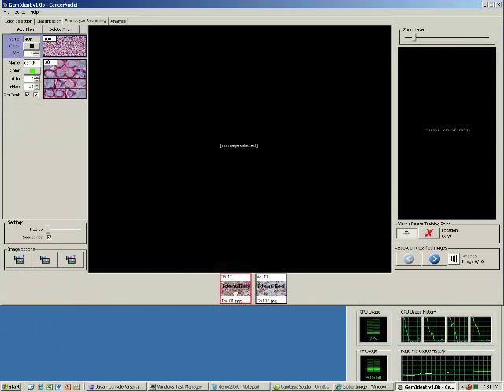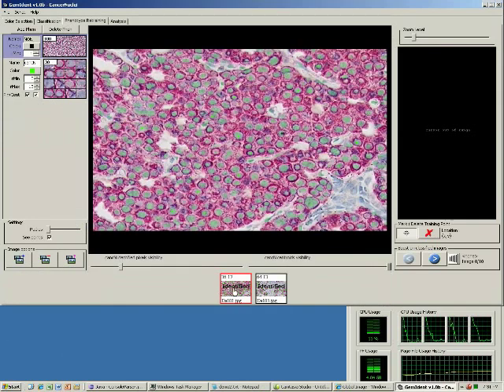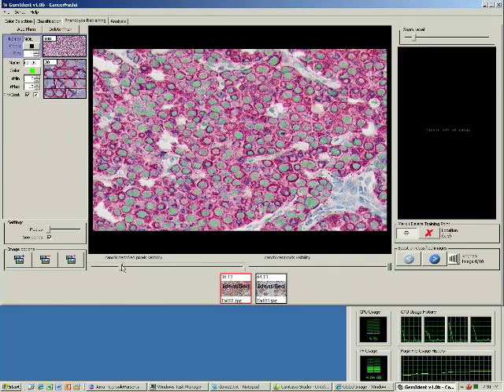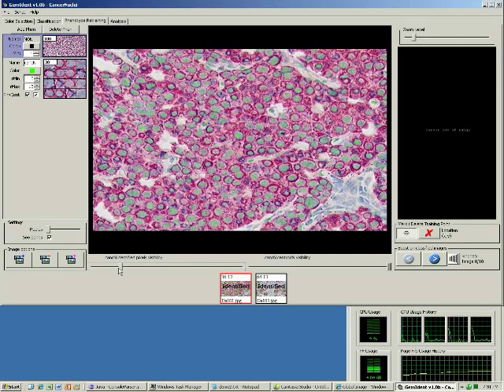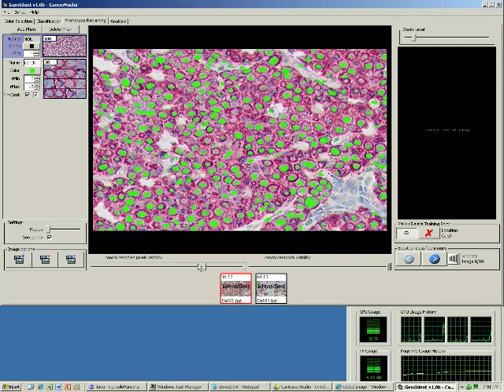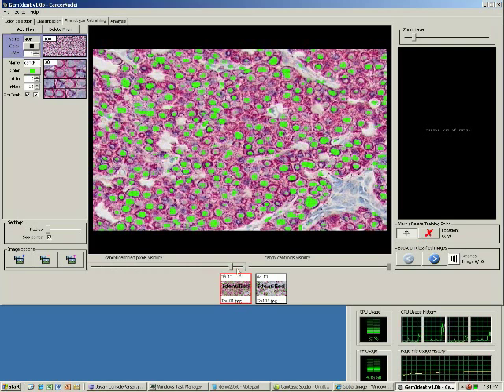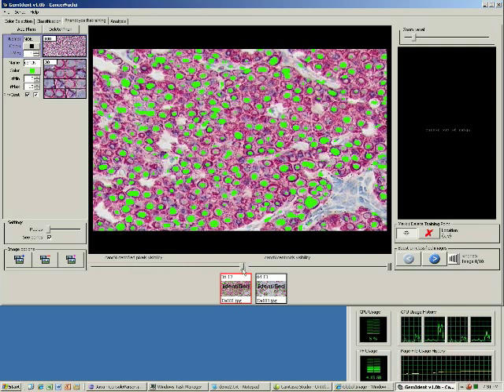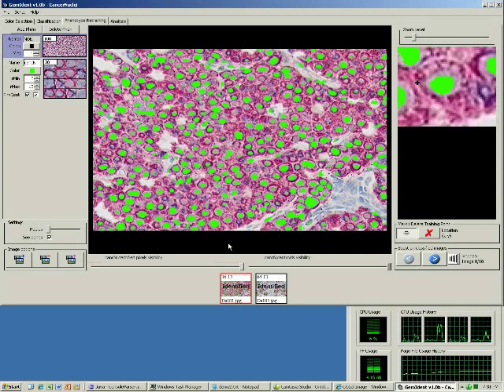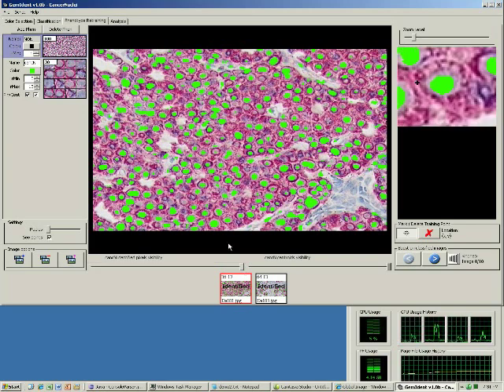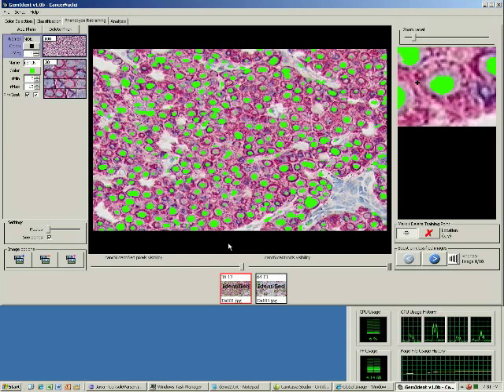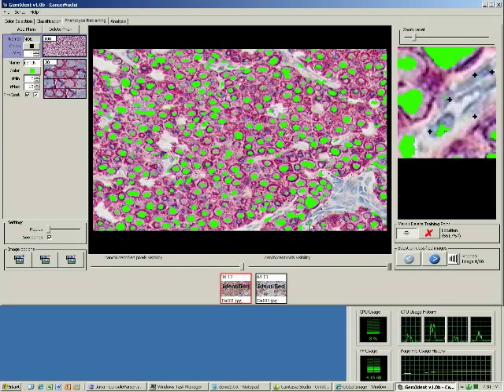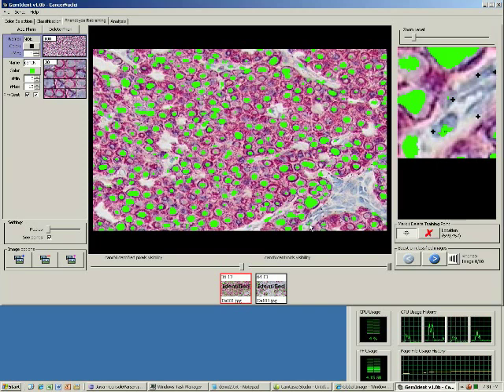Let's begin with the initially trained images. Gemident gives us these handy sliders that control the opacity of the classified pixels. We can also turn the visibility of the training points on and off. Notice the regions of false positives. Let's retrain over them with the none.